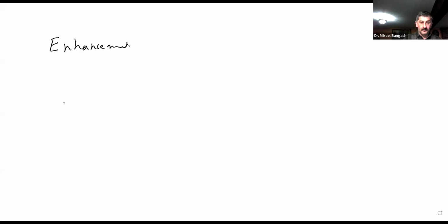Now, first of all, it is going to appear as hyperechoic. Clear?